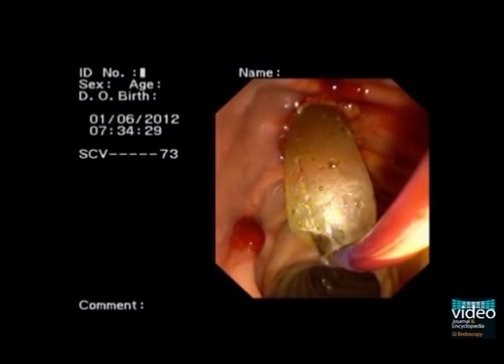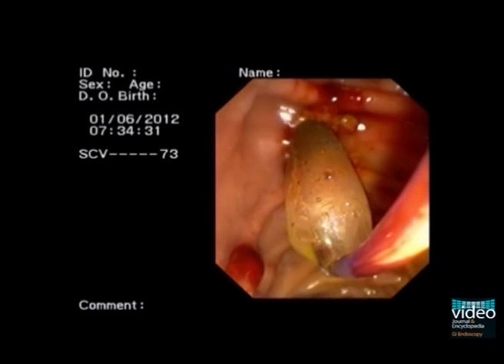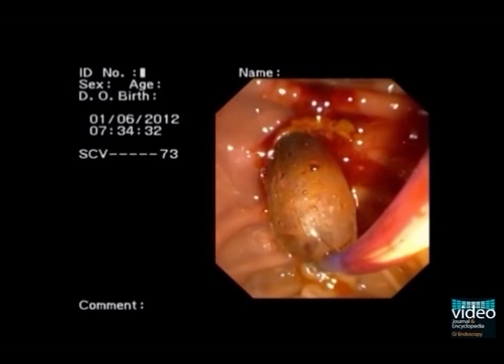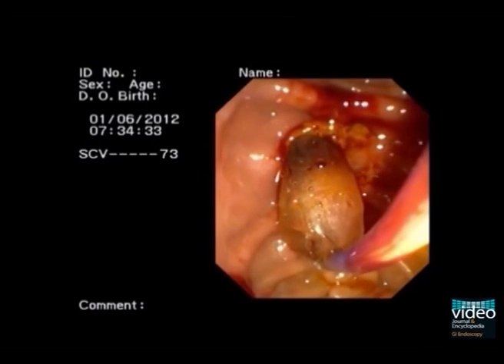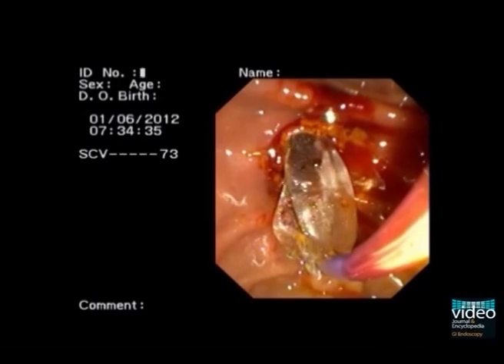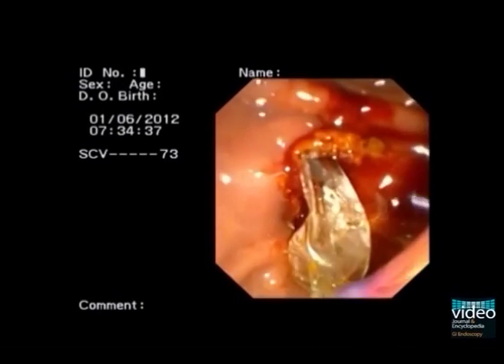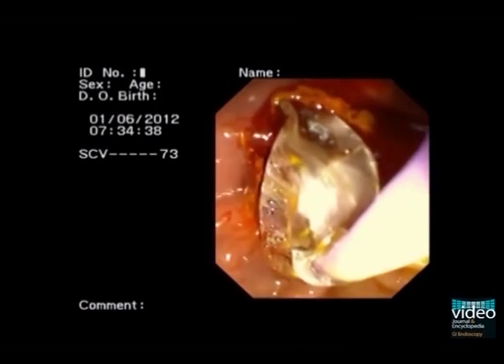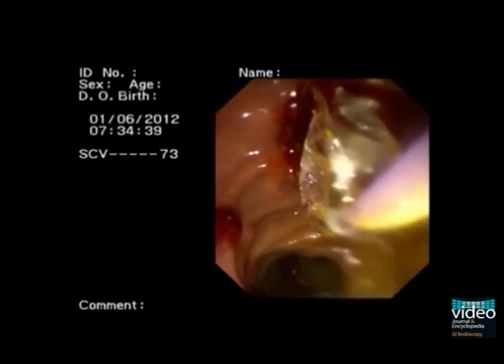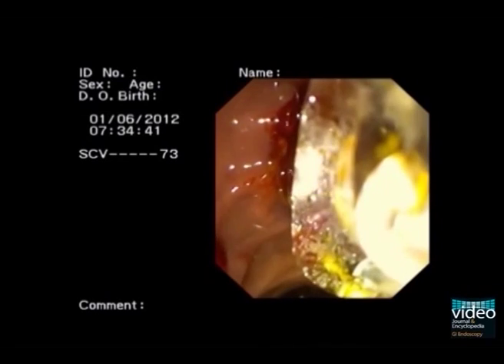Deflation of the balloon. A small amount of blood oozing hemorrhage is noted.